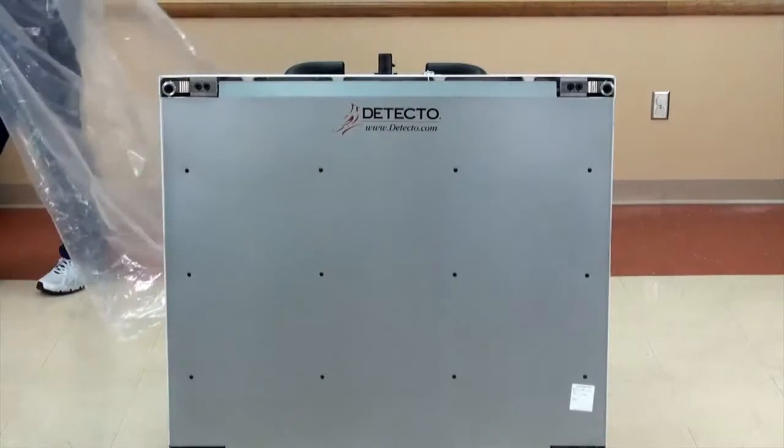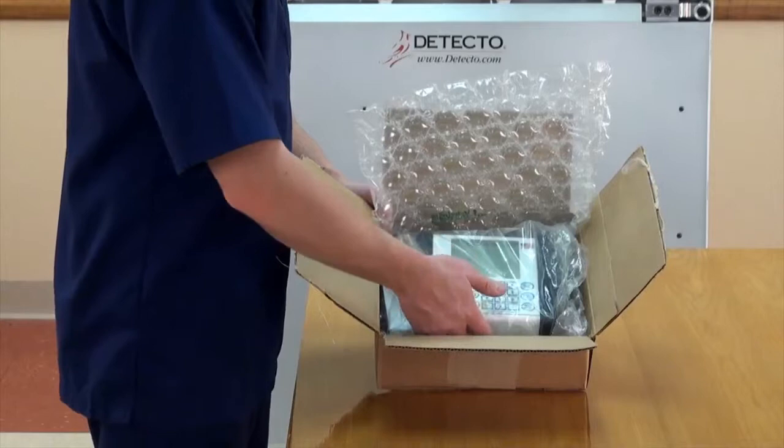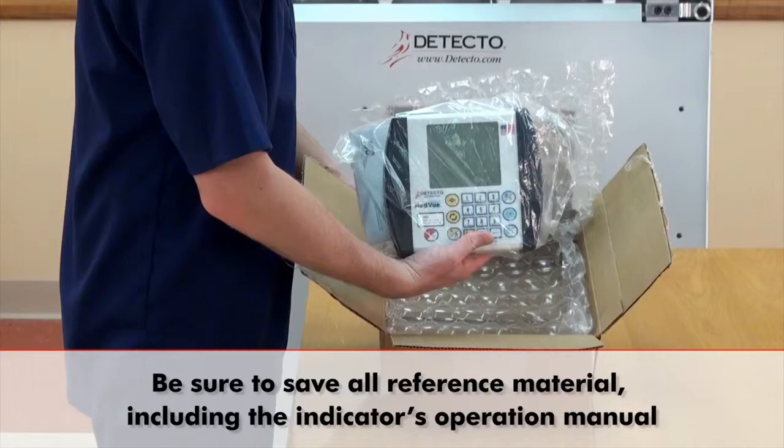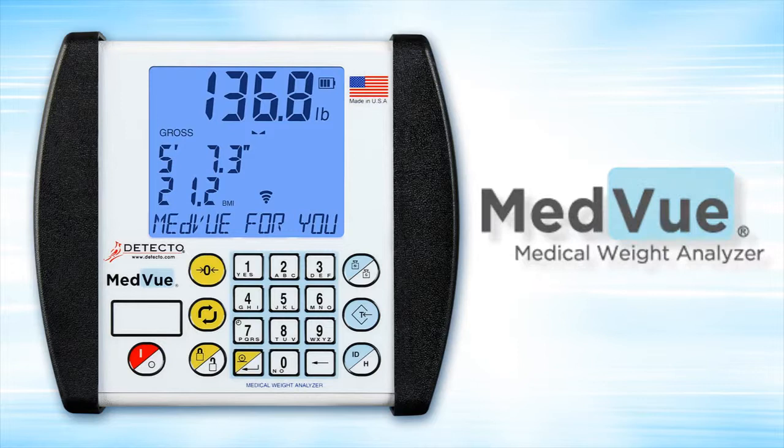With the scale safely standing upright, you are now ready to attach the weight indicator, which you will find in the small box that is packed in the carton. Carefully open the box and remove the indicator. Be sure to save all reference material, including the indicator's operation manual.